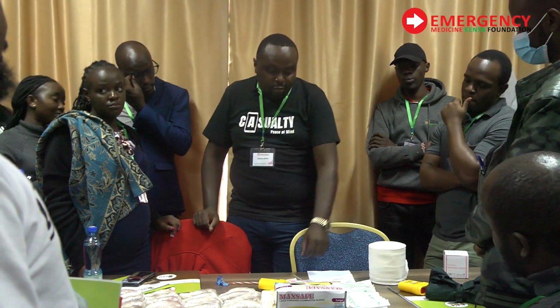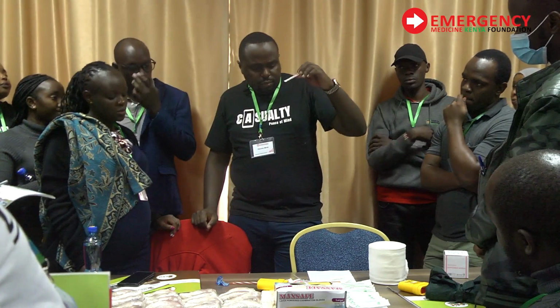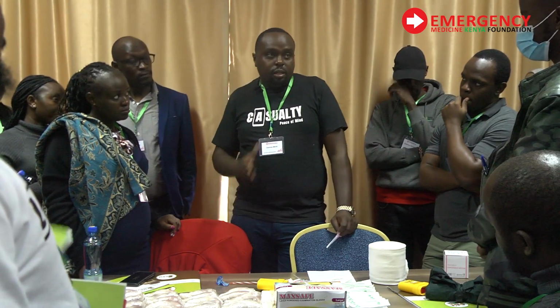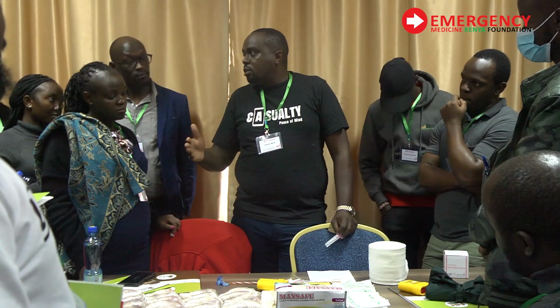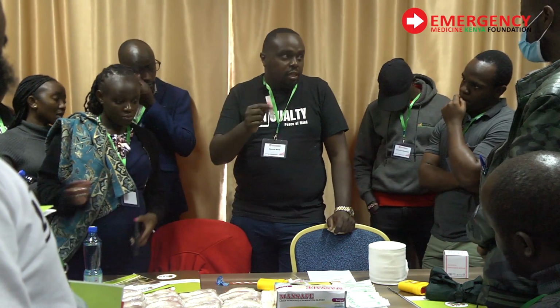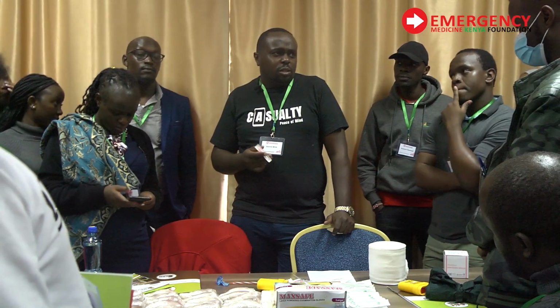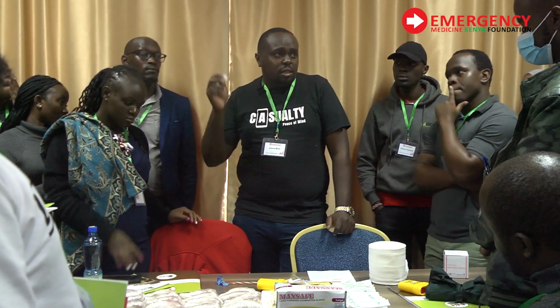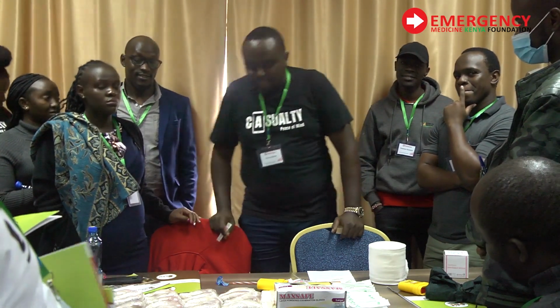For example, the one I have here is not very big, but for this purpose it will be good. This is a gauge 18. So I think the needle size increases as the gauge reduces. So by the time you get a gauge 16, it should be bigger than this. You get a 14, it should be much bigger than this. I think the 14 is the one they use for domestic animals, but it will help you access the bone marrow.